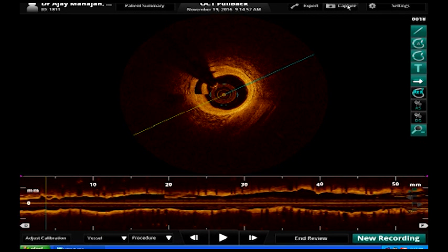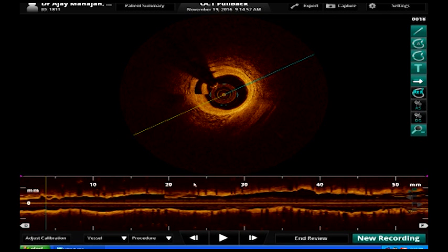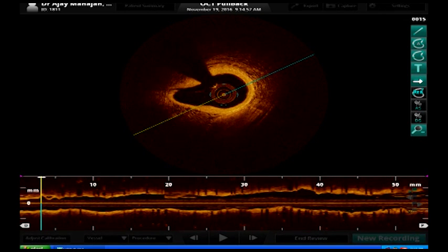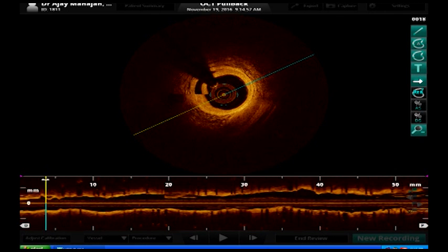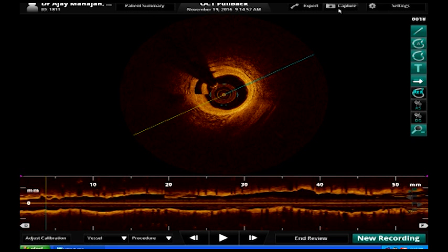But this is all new data that's coming up. We don't know. There is no consensus. If you ask Patrick Serruys, he'll say every 270-degree dissection has to be treated with a stent. But we really still don't have a great idea about this. Yeah, but Ramesh, you cannot stent that outflow. Stenting is not a great option in the distal outflow because of mismatch of the size.